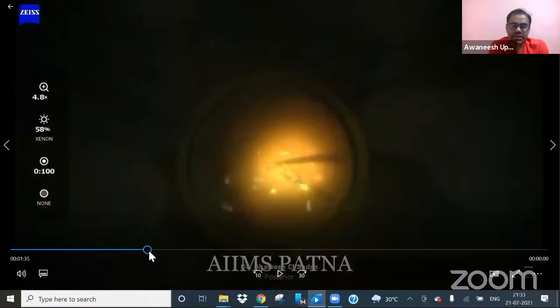Let's get with Dr. Chitranjan Mishra first. Dr. Chitranjan, can you just tell me how do you go about with IOLs? We have different case scenarios here where the IOL sometimes stays back in the anterior vitreous space, sometimes in the mid cavity, and sometimes over the retina. So how do you actually go about with IOLs which are in the anterior vitreous space? Do you want to do a vitrectomy and let the IOL fall into the vitreous cavity, or do you have any other methods? Can you give us some pearls about how to go about with them?